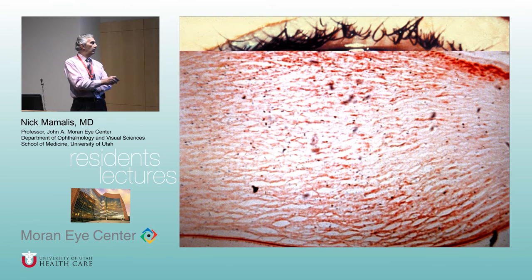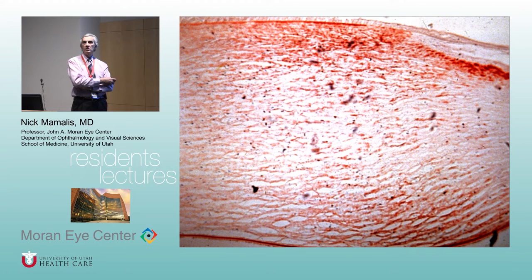And what is the material in arcus senilis? Is it also calcium? Nope. I'm not sure. It's actually lipid. So it's a lipid deposition. And so if this is indeed lipid, and I'm showing you this slide, what stain would this be?